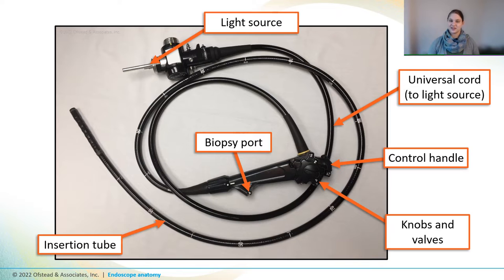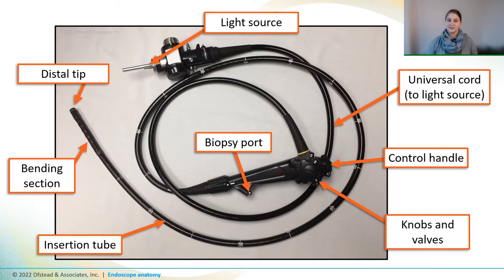Now this whole thing is actually pretty flexible, but there's a bending section on the end that is designed to be angulated right and left or up and down. And the distal tip has the lens and light sources necessary for seeing inside of patients.